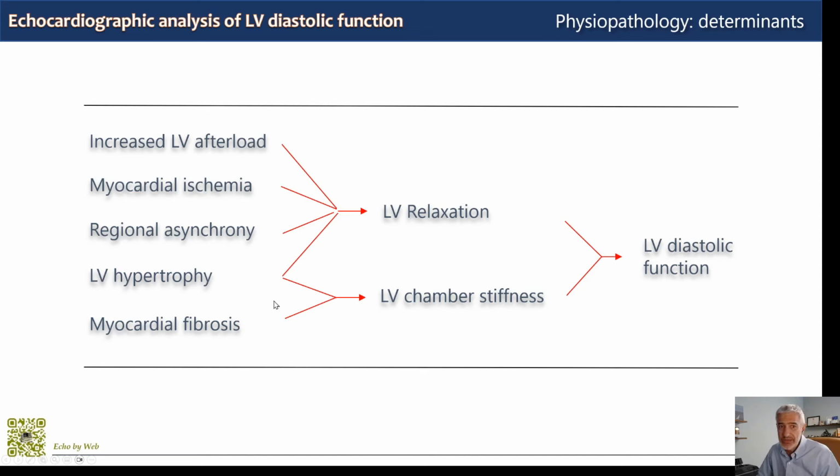It should be remembered, ventricular hypertrophy tends to both prolong relaxation, and when moderate to severe tends to increase chamber stiffness. It should be remembered also that both myocardial ischemia and ventricular remodeling in general tend to influence ventricular relaxation before it influences contractility.